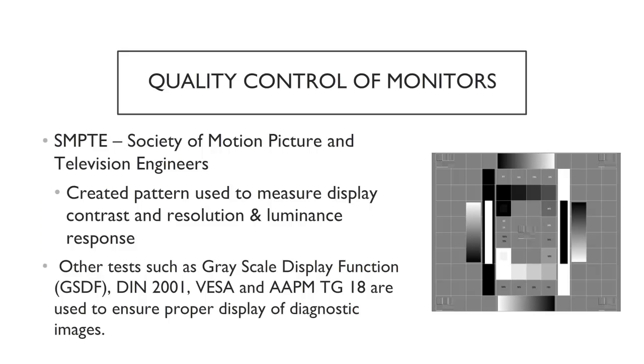Because of the dependence on the quality of the displayed images, medical imaging departments must test monitors for accuracy and standardization of display. This is accomplished through a number of tests, including a well-known SMPTE pattern. The Society of Motion Picture and Television Engineers created a picture tool that is displayed on monitors and evaluated for optimal contrast and resolution. Other patterns and tests exist, but the SMPTE pattern is a common one that you may encounter, and it tests the luminance response of the monitor.